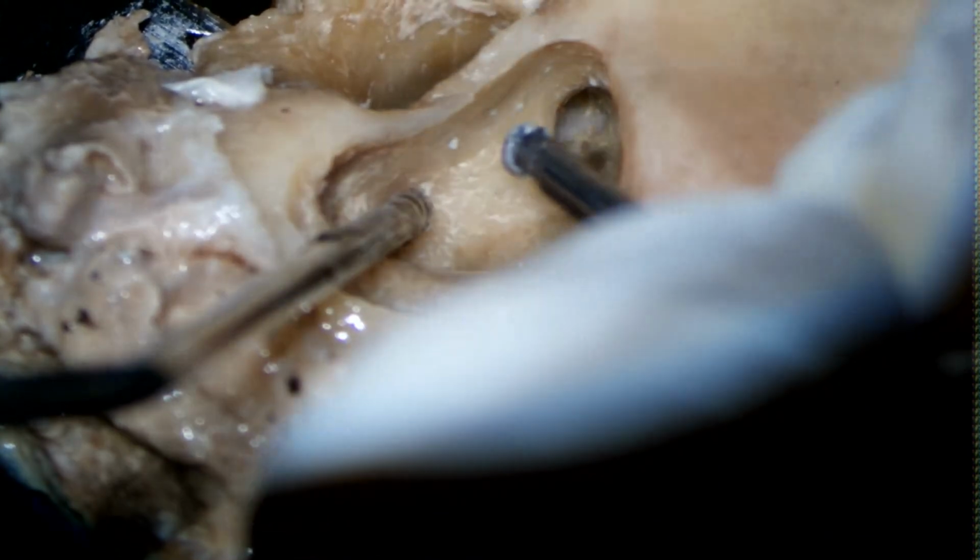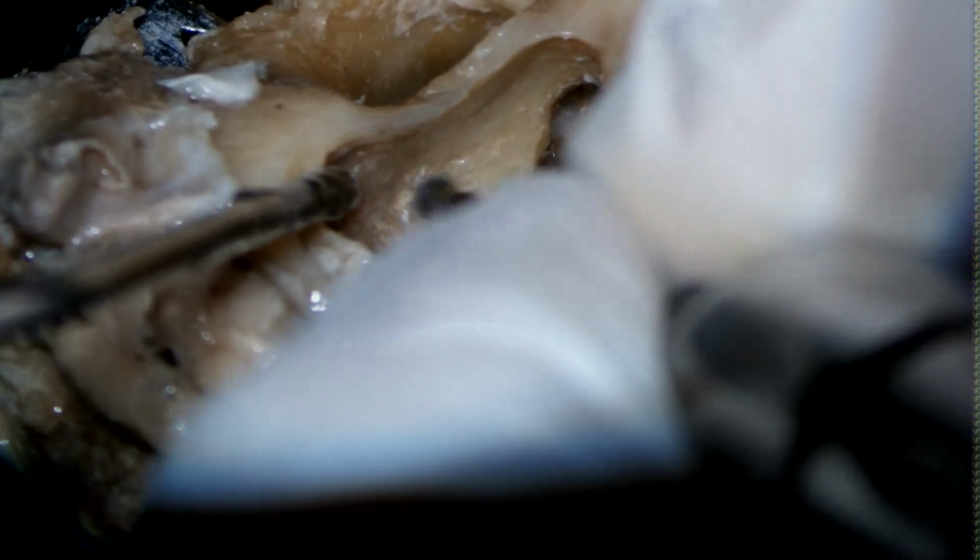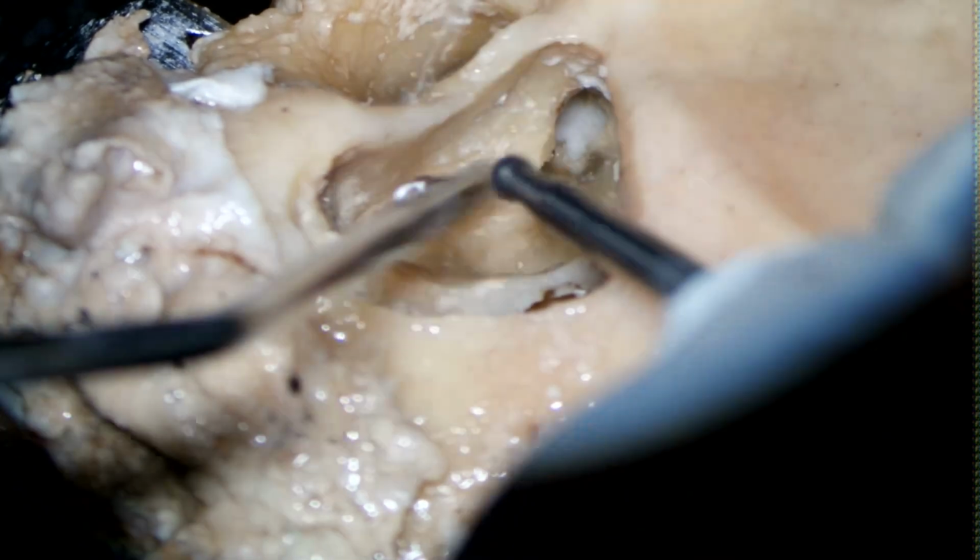Yes. So here you can use a diamond burr to remove bone gradually and identify the nerve.